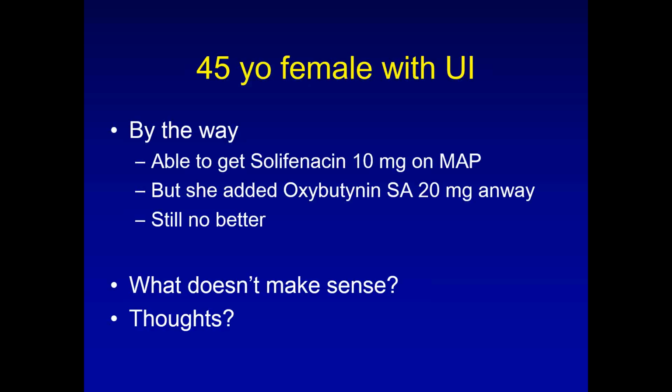Did she empty? She emptied all the way. With straining. Yeah. But she had a low PVR, 10 or so. So her youth did that for her. I notice in youth they are better strainers than the elderly. I agree with you. So do you do your own urodynamics? Yes, for Georgia Urology. What do you guys get before they come into the urodynamics room?